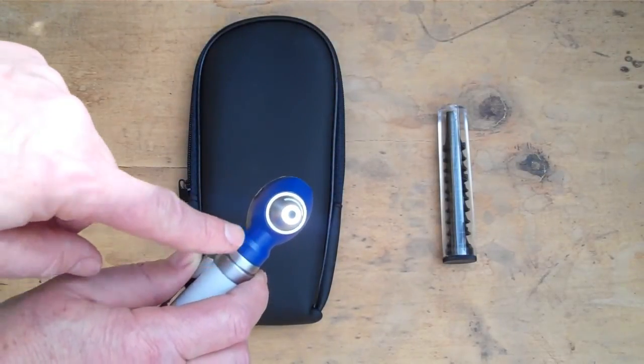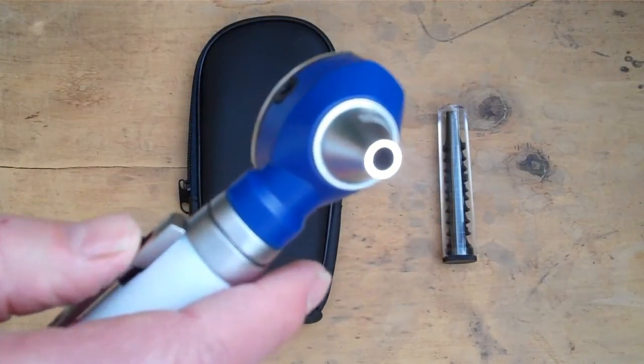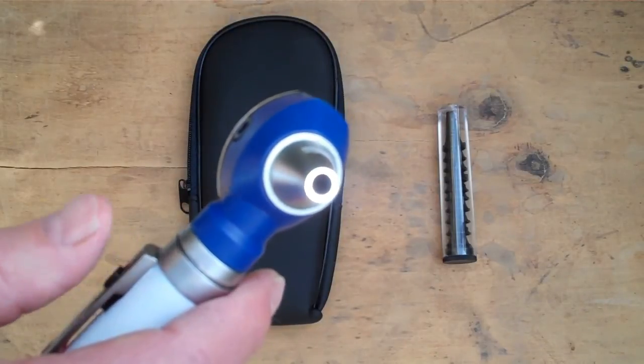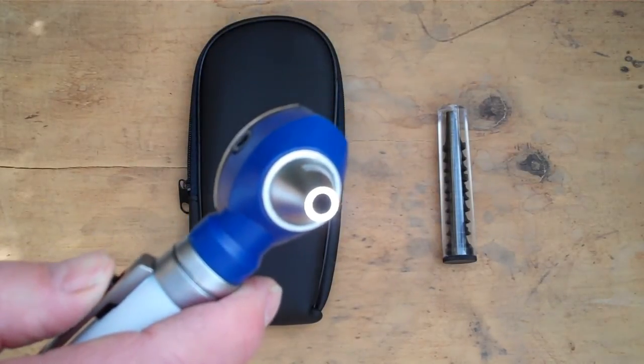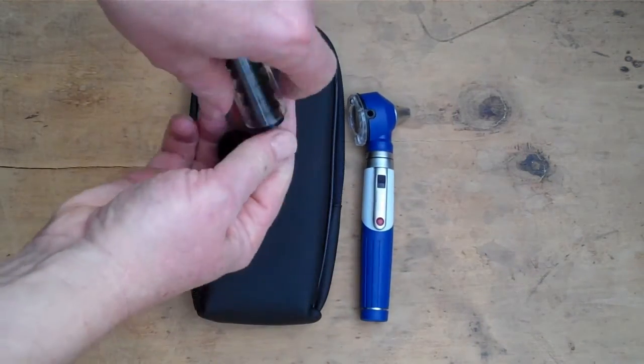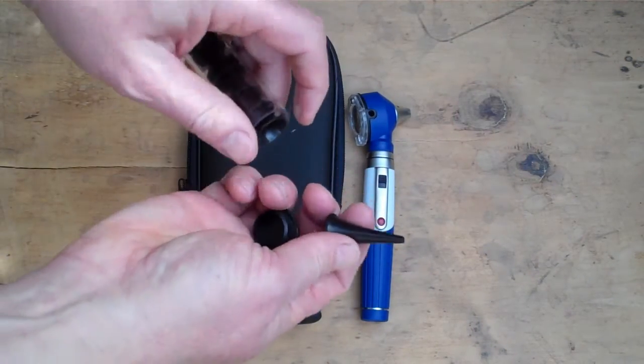As you can see in this demonstration, bringing it up to the lens, the light source is a very nice bright white medical examination quality light.